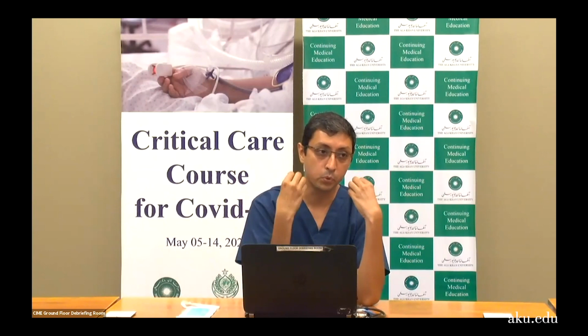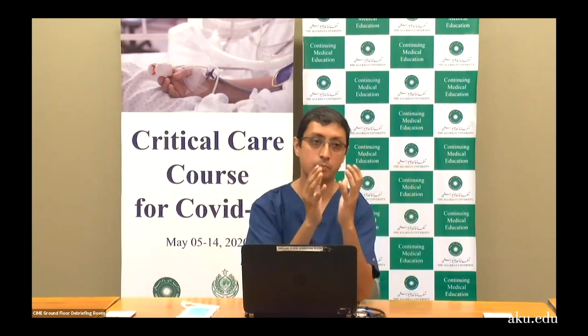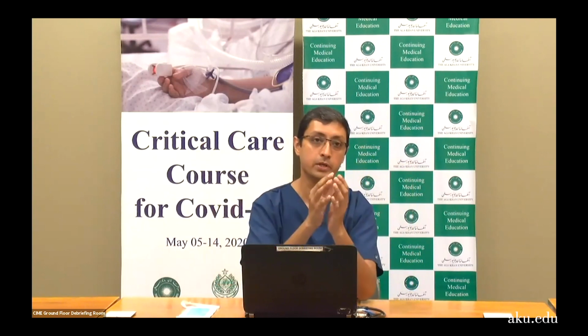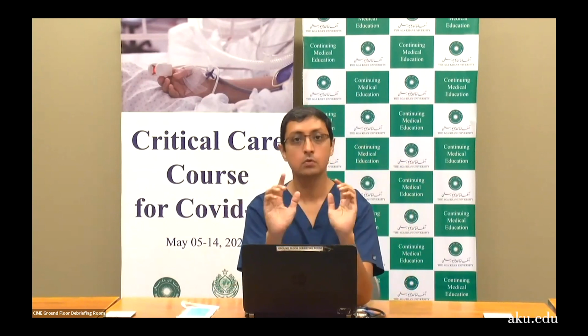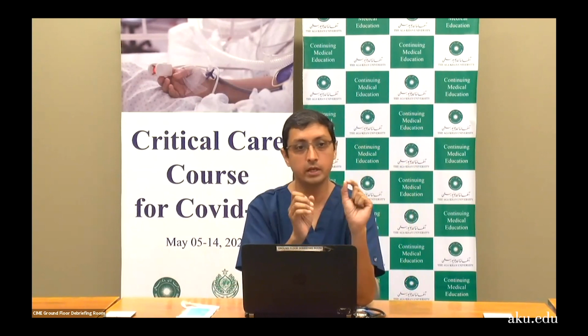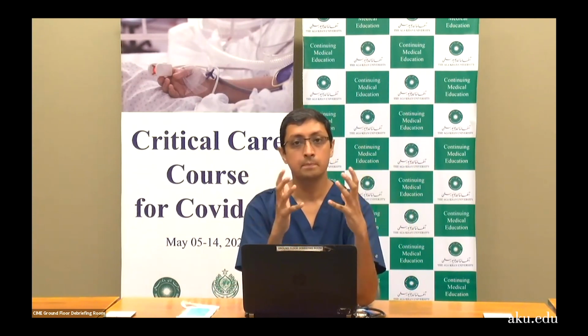You blow air in, and some balloons will inflate quickly, some will inflate less. The ones that inflate quickly have higher compliance, and the ones that inflate less have lower compliance. A combination of all of these. So we cannot measure individual alveolar compliance. We look at the total. We look at the lung compliance, because with millions of alveoli, individual numbers won't help. So we look at the lung compliance in total.